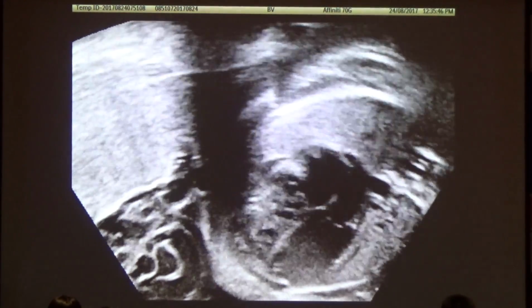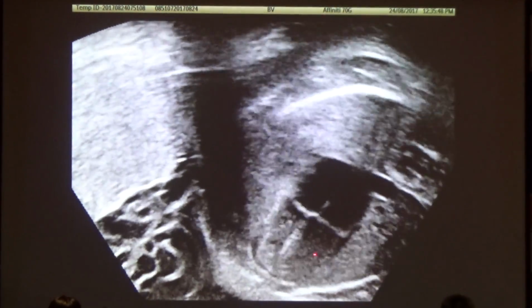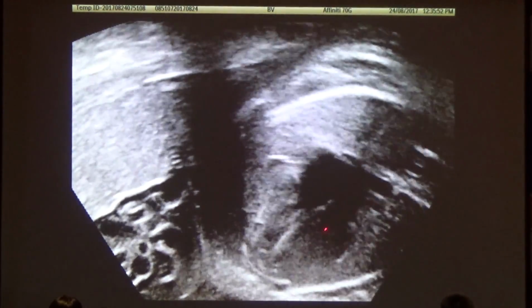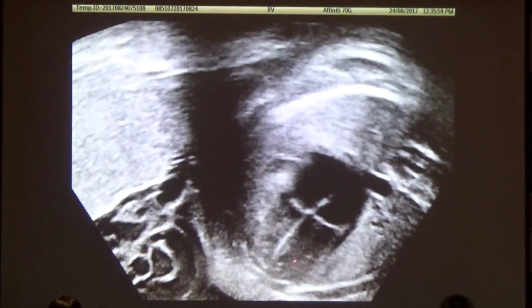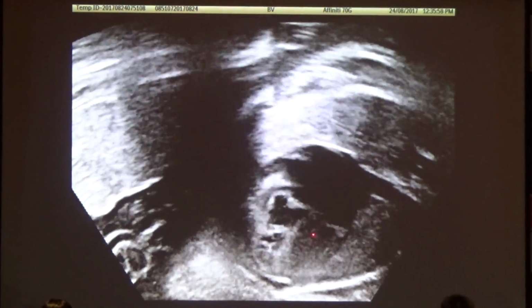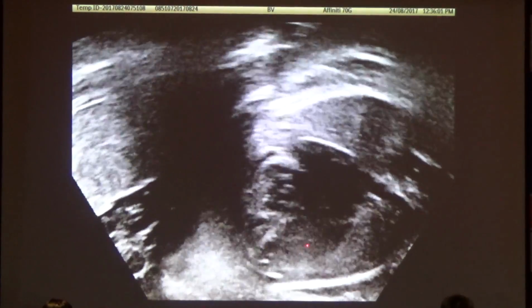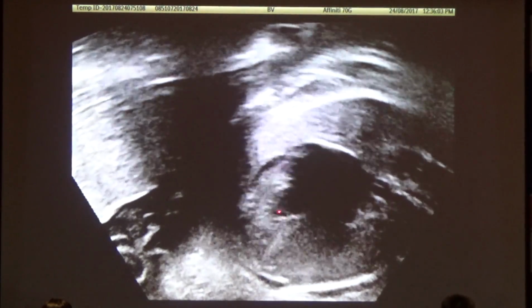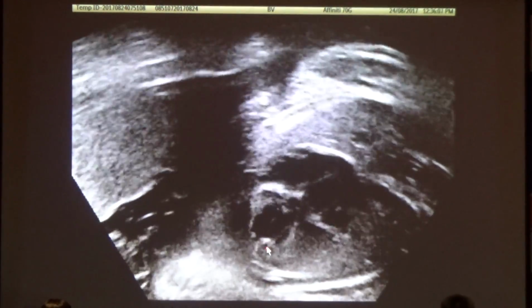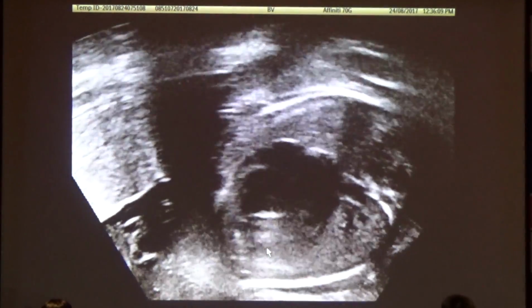So which is the left ventricle and which is the right ventricle? We just had a thing on normal left and right ventricle. Yeah, I'm going to tell you because I'm the teacher, right? Right. Okay, I'm just checking. This is the left. Okay, so look at all of the trabeculations here. Right.